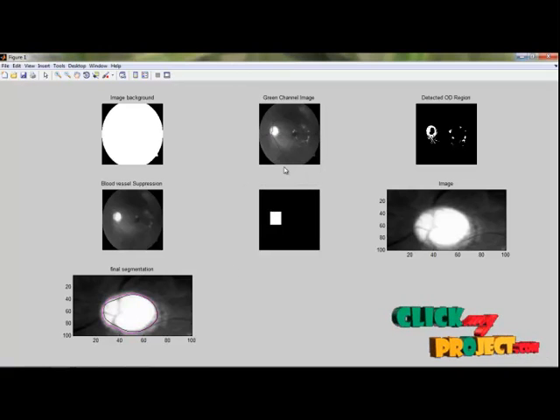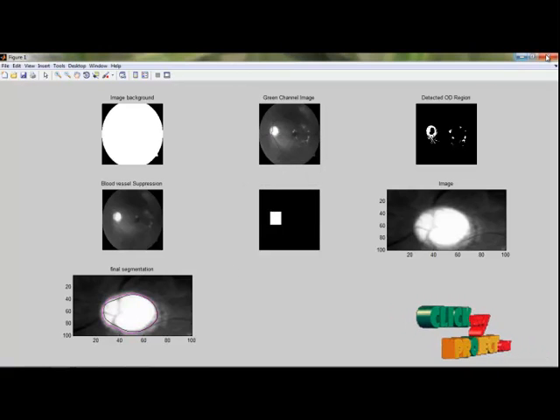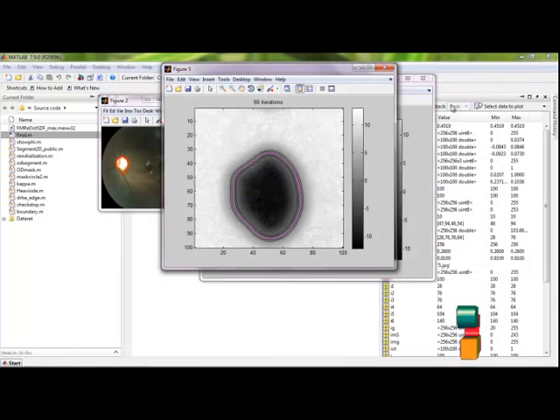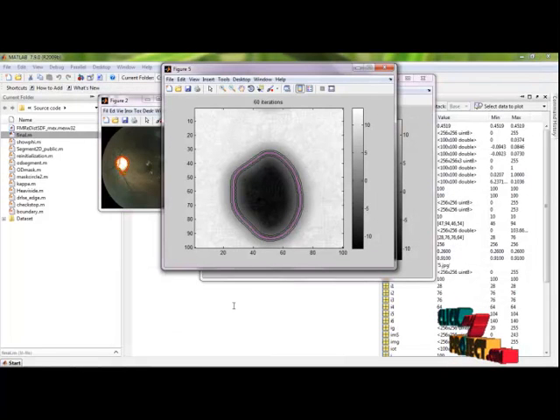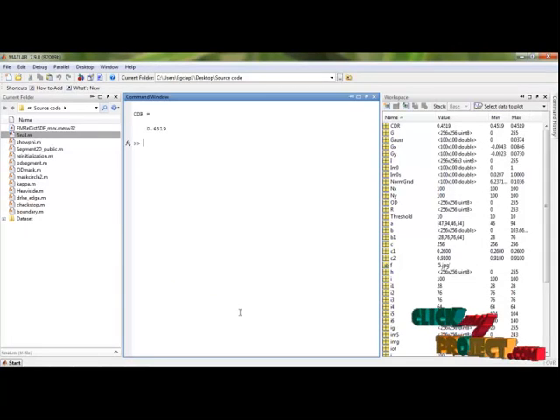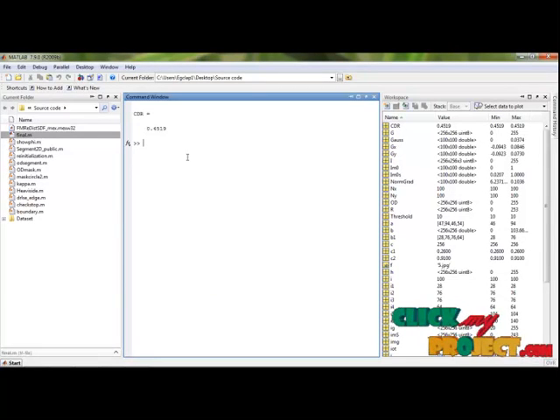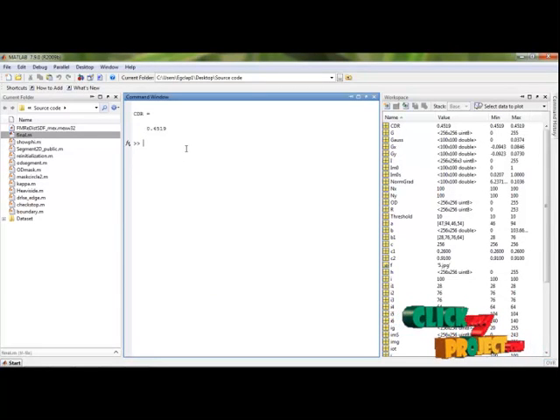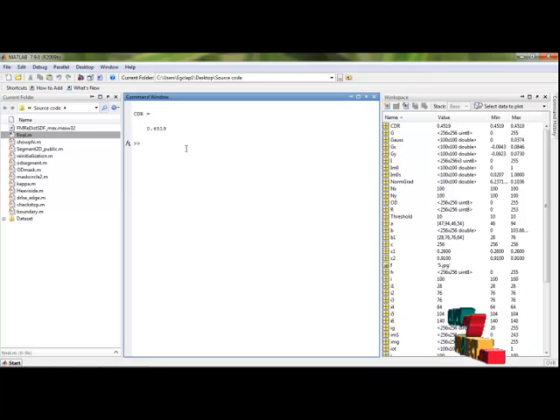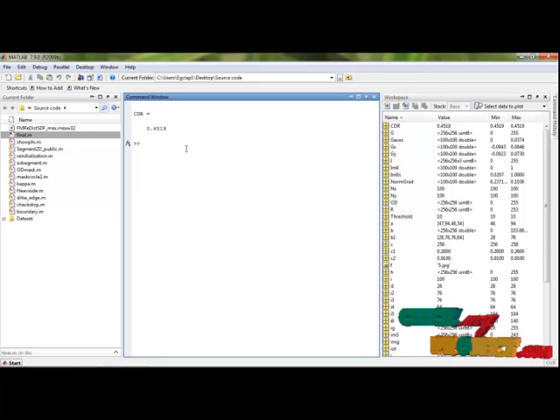Thus we segment the given retinal image, detect the CDR value, and finally calculate the level of the given image.